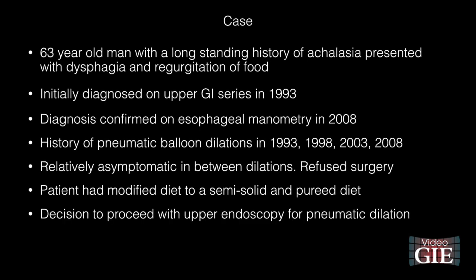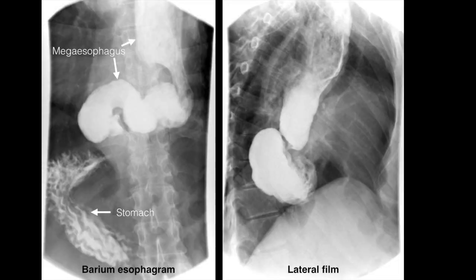We decided to proceed with upper endoscopy for pneumatic balloon dilation. Previous barium esophagram had shown a markedly dilated and redundant esophagus with pooling of contrast, absence of peristalsis, and very slow passage of contrast into the stomach, consistent with achalasia.